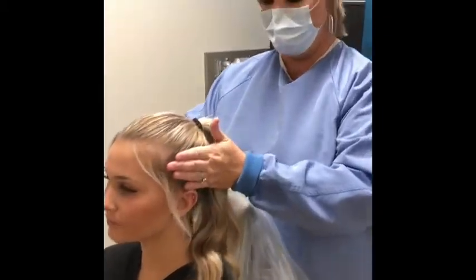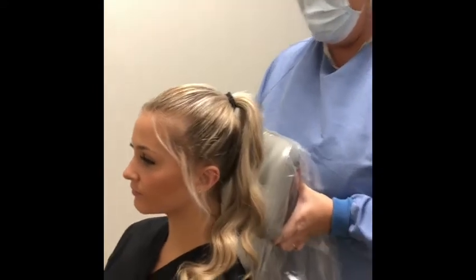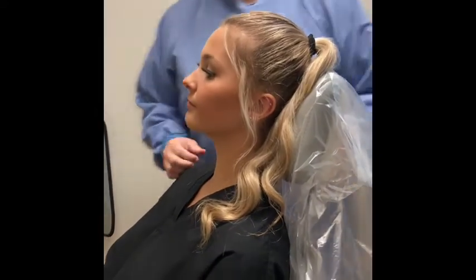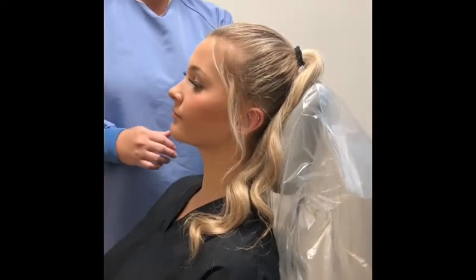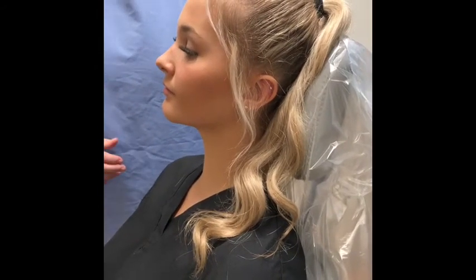So her head is much taller than where my headrest is. So I'm going to go ahead and bring my headrest up. Okay, go ahead and rest your head against the headrest there. Perfect. And then we want to just make sure the occipital protuberance, which is the back of the head, is nice and flush with the headrest. And then our mid-sagittal plane is the tilting position of our patient. So we need to make sure that their head is nice and perpendicular. She's not tilted one way or the other, or chin too high, chin too low, just nice and flat here.